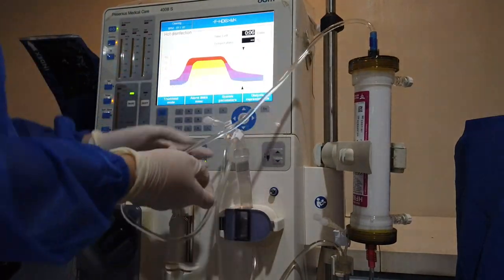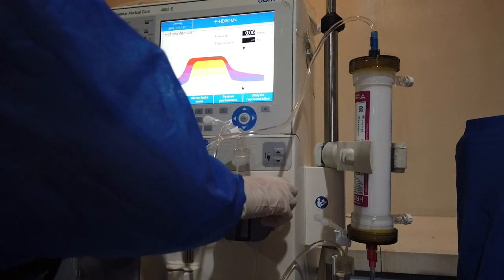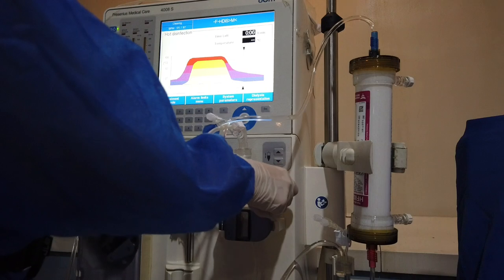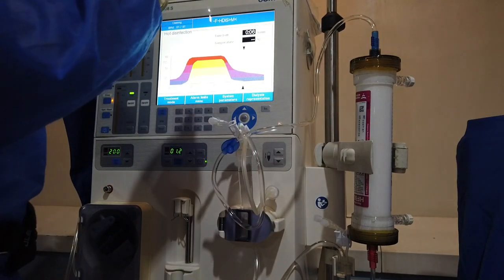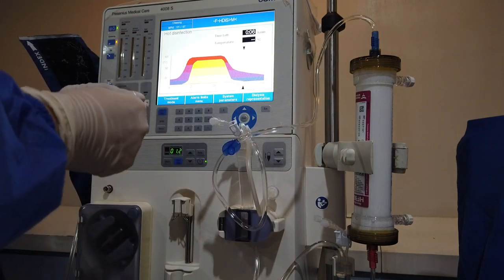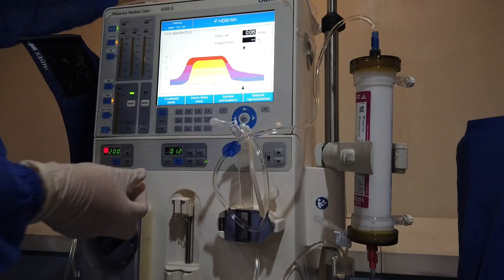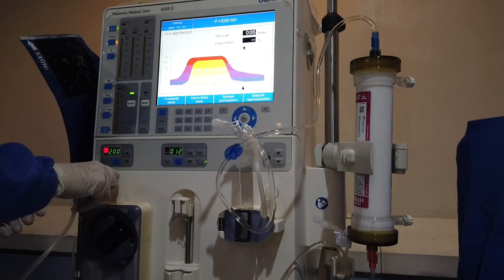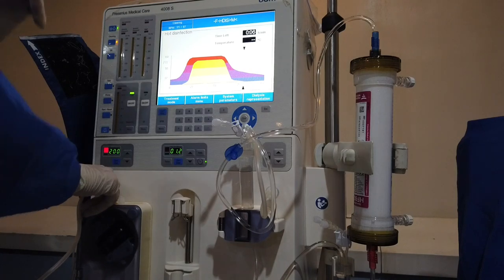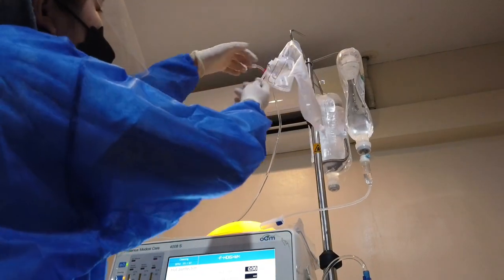Place the chambers in its proper position. Then don't forget to attach the transducer lines to the transducer pods. The transducer protector of the venous part is already attached, but for the arterial part, you have to make use of the sealed transducer protector and connect it to the line, then attach to the transducer pod. Close the drainage bag clamp and the blue big clamp.